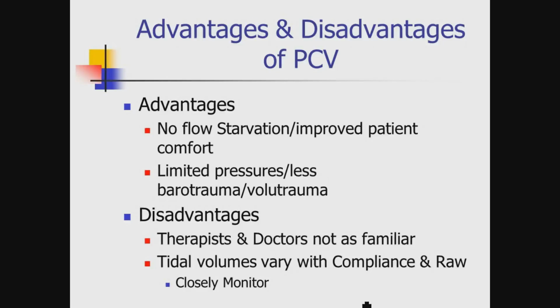Good news about pressure-based ventilation, why a lot of people really like it: there's no flow starvation. Flow is variable. You want more flow, take more flow. In a lot of patients, it becomes very uncomfortable being told how much flow you will have. They'll tell you, I don't feel like I'm getting a full breath, and you're thinking, oh, the volume must be the wrong volume. It's really the peak flow rate. They're not in control of it.